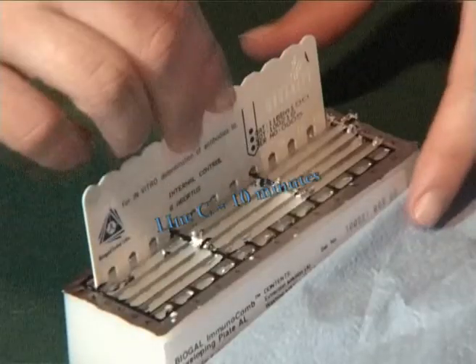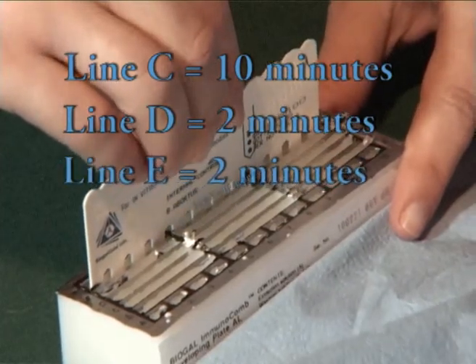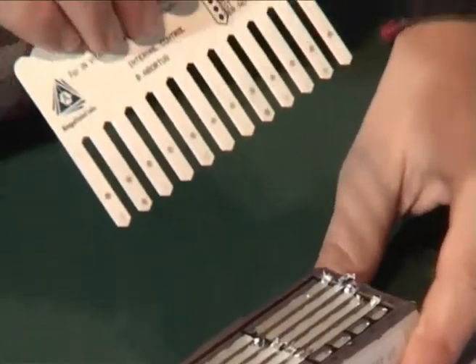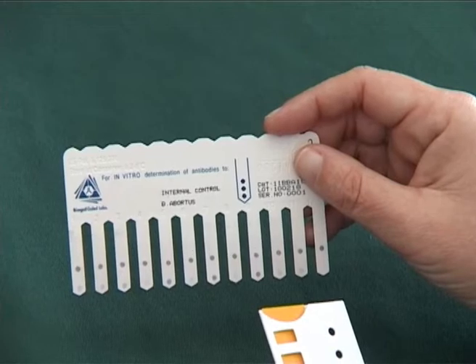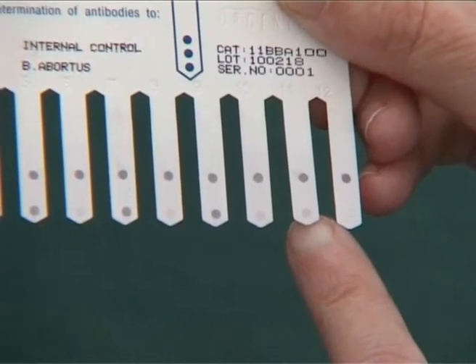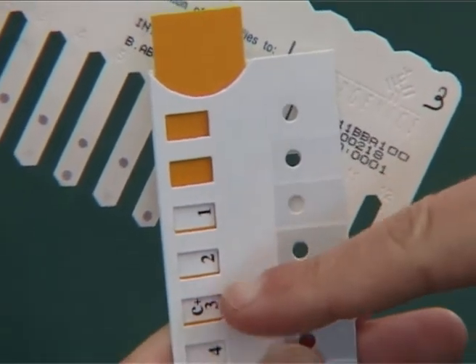Dip the comb in line B and proceed in the same way as in line A, and so on to complete the process. When the comb is completely dry, align the comb scale and compare the color obtained with the positive control color scale, and slide the slider until C plus three appears in the window.